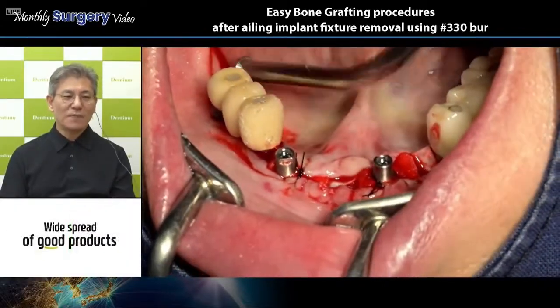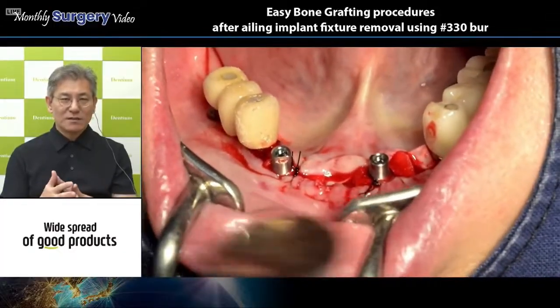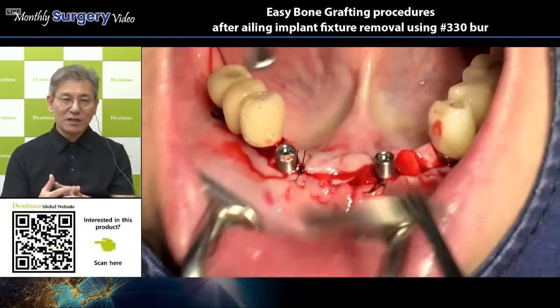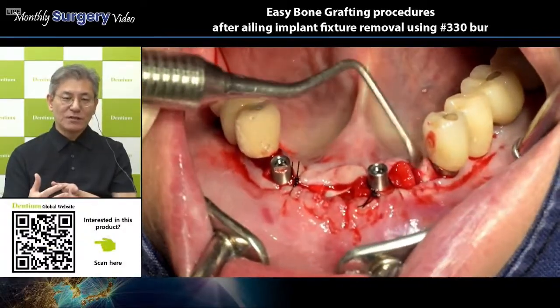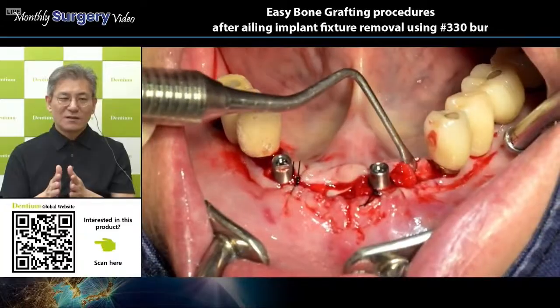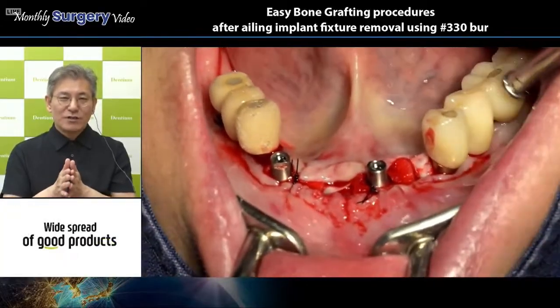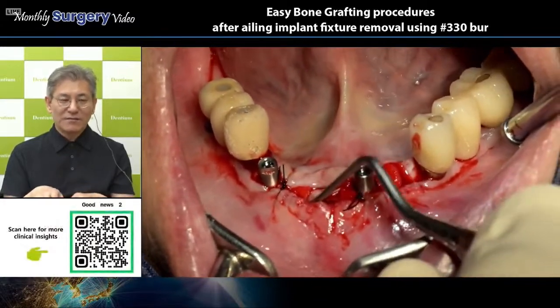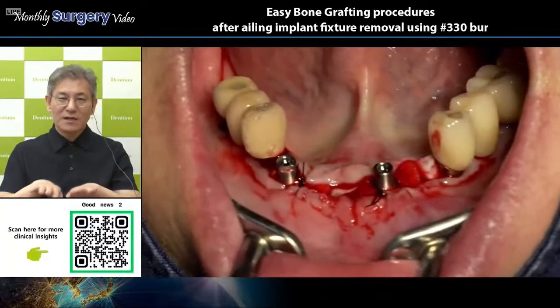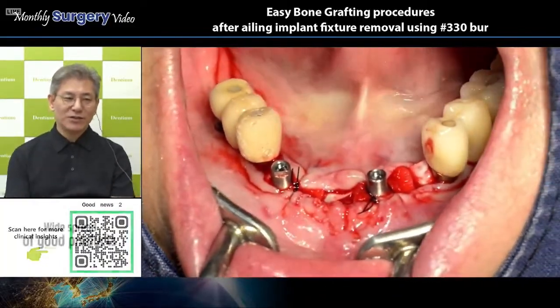So at this time, the flap is exposed, and there is some shrinkage during the healing period, the flap shrinkage, right? During the suture, maybe a little bit of tension, and the flaps collapse and shrink toward each other.